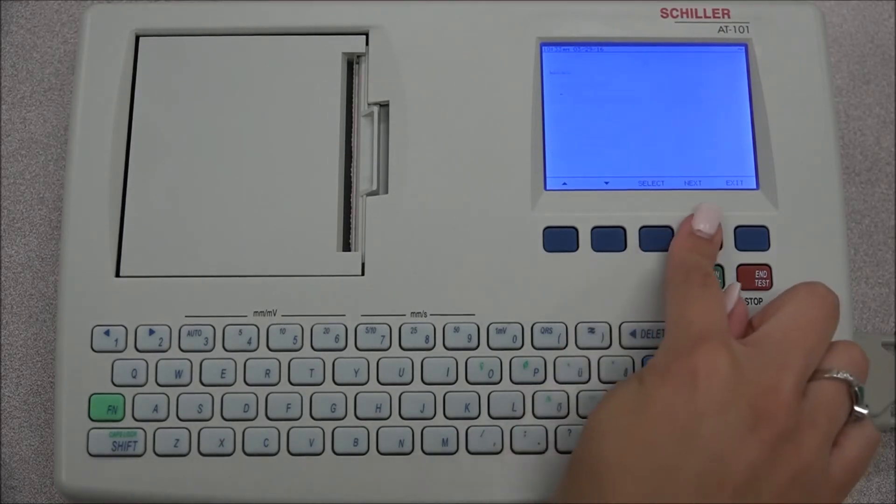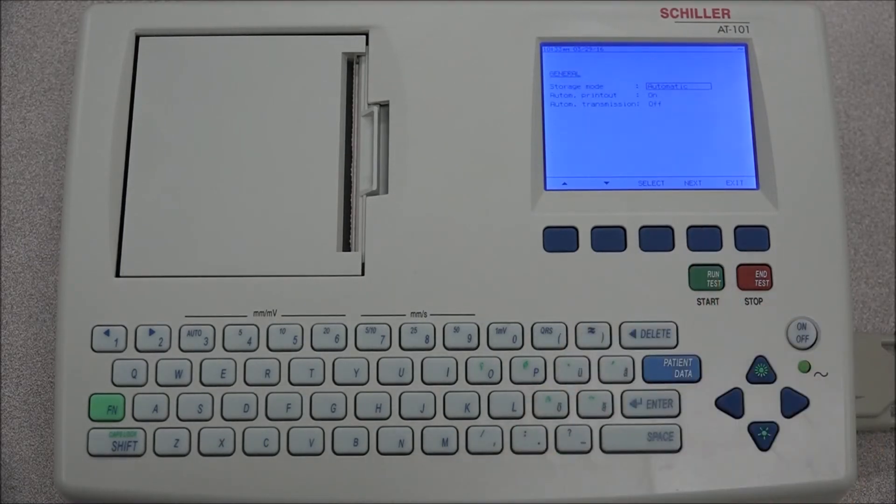Under general, the auto-storage can be set to automatic, manual, or off. This means that once a recording has been made, it will automatically be stored if set to automatic. The automatic printout can be turned on or off, as well as the automatic transmission.